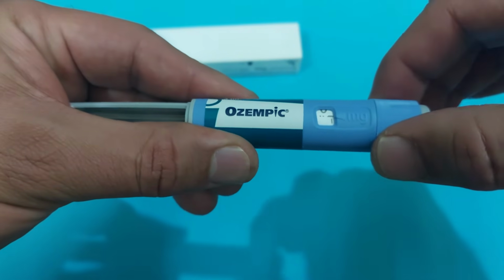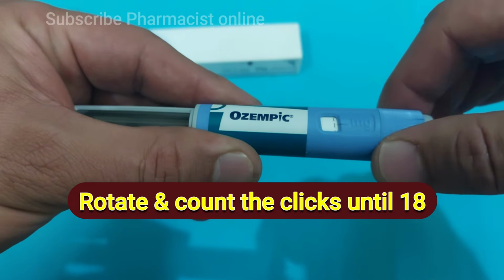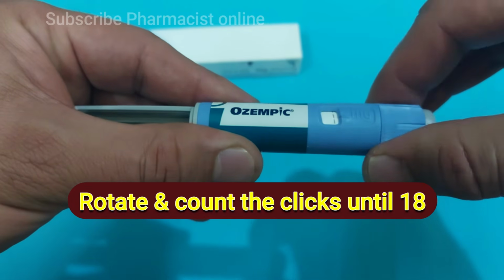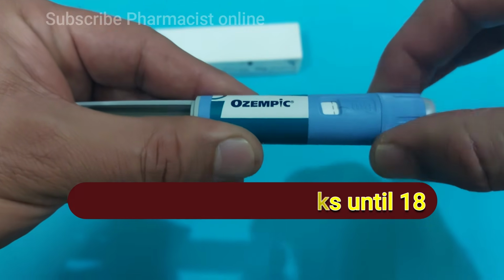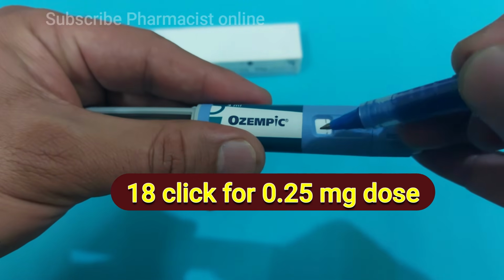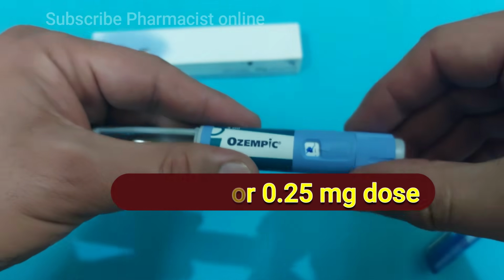this is the first click, then the second, third, fourth, fifth, sixth, seventh, 8, 9, 10, 11, 12, 13, 14, 15, 16, 17, 18. So this is our 0.25 milligram dose. It is better to mark this with a marker, so next time when you come here, this will be your first dose.